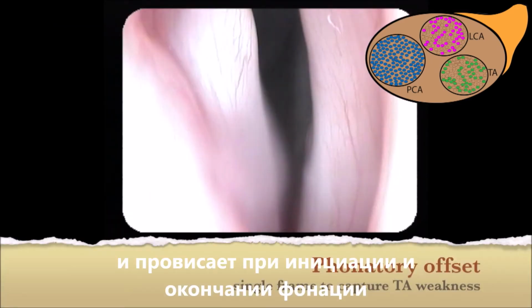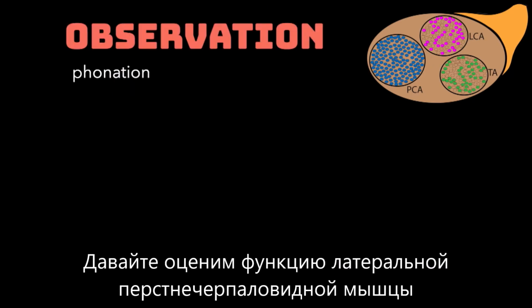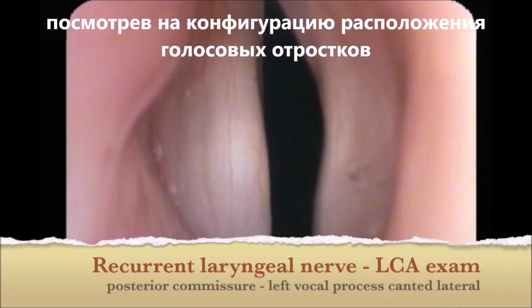Again. Slow the video down. The left vocal cord is fluttering at low pitch, remaining lateral to its axis, and is bowed at the onset and offset of phonation. While she is topically anesthetized, though, let's also get a close look at what the lateral cricoarytenoid muscle is doing by looking at the configuration of the vocal processes in the posterior glottis. For this, you need to push the endoscope way back underneath the arytenoids.